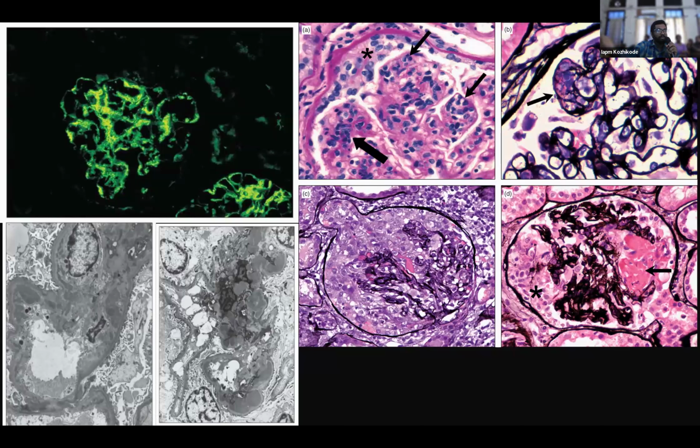Mesangial hypercellularity we already have. If deposits, like antibodies and complements, are there in the subendothelial space, you should certainly get inflammatory cells there also. So you will have endocapillary hypercellularity, and after some time we will see the crescents also. You can have the crescents also.